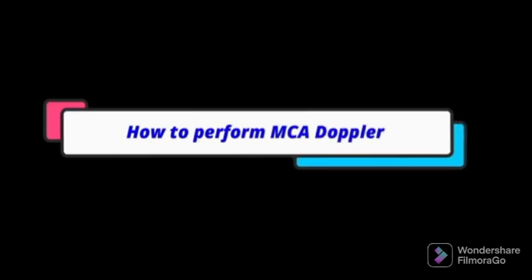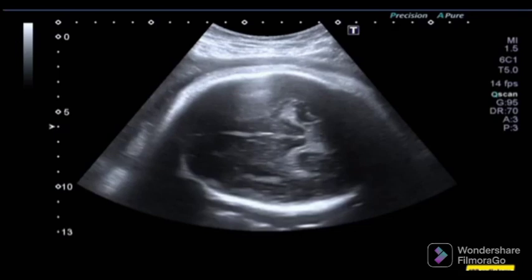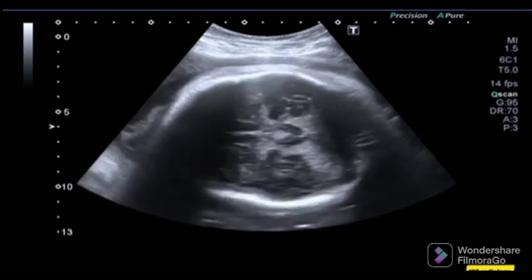How to perform middle cerebral artery Doppler. Start with the biparietal diameter view. Move caudally to visualize the butterfly shape of suprasellar cistern.